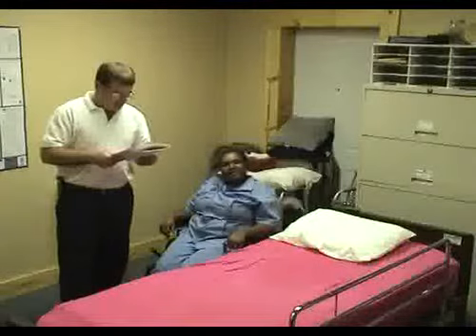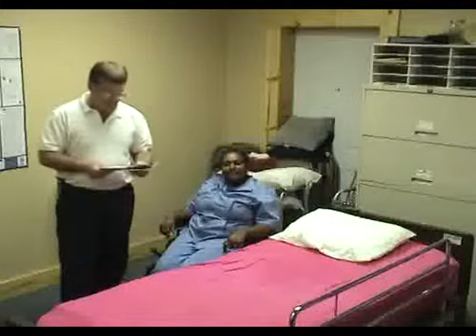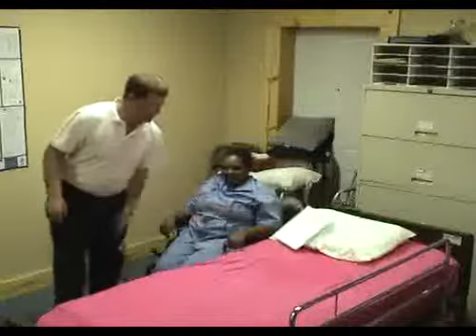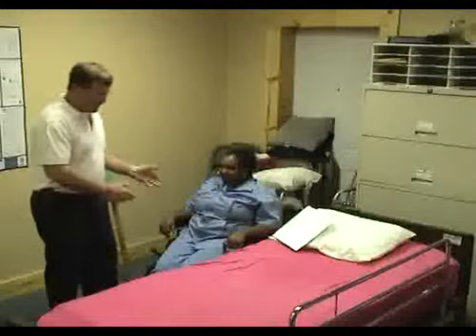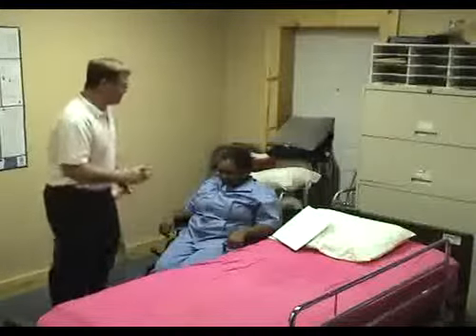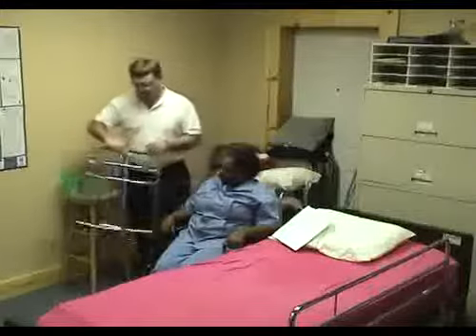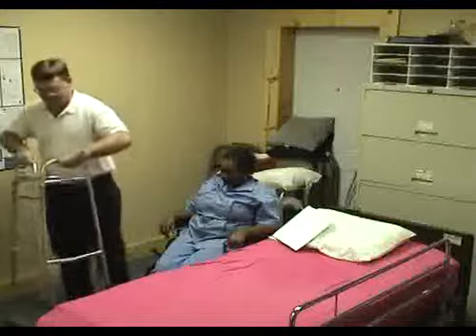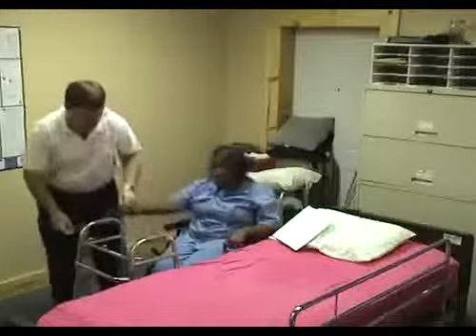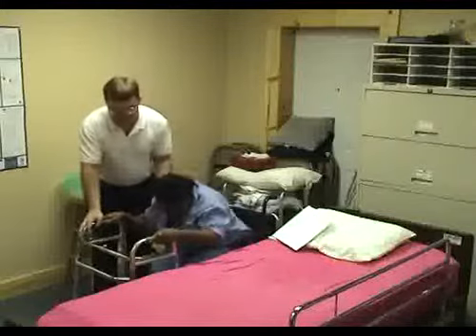Number 5, assist client to pivot into the chair, which we did. And number 6, assist client back in the bed simply by reversing everything we did. She would get up from here, we would assist her to turn and assist her to sit. If she was able to do most of it on her own, you simply may need to put a walker up in front of her. And say, okay, Nellie, lean forward and let's push. 1, 2, 3.